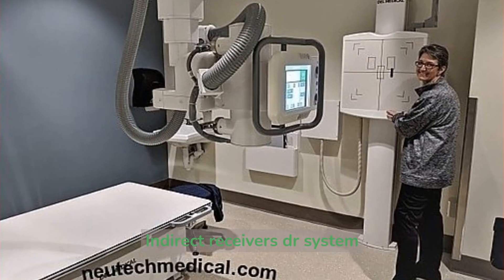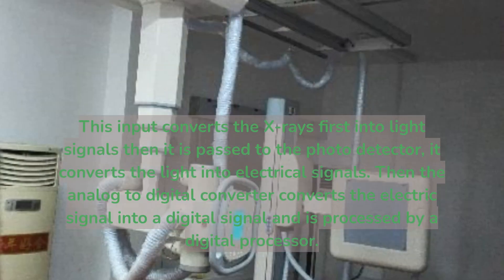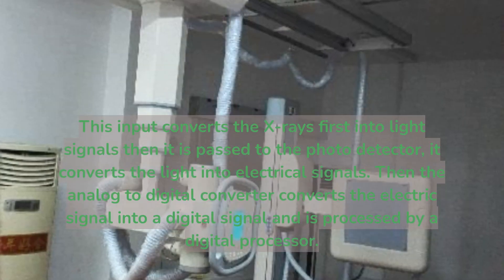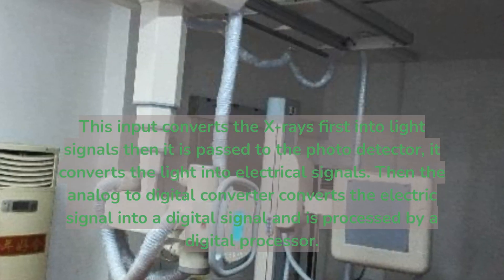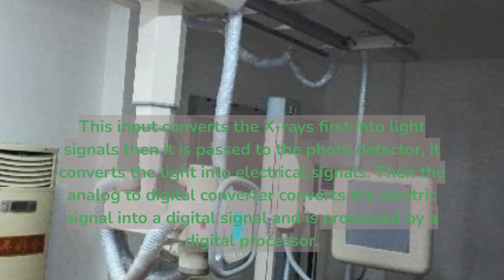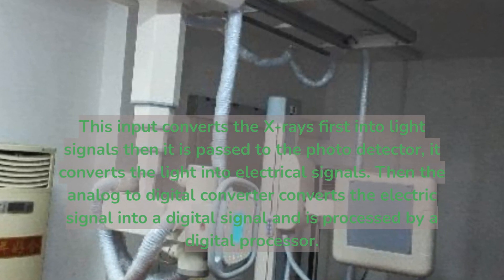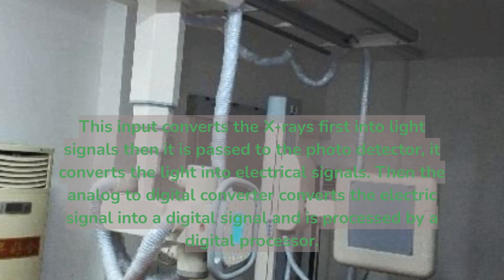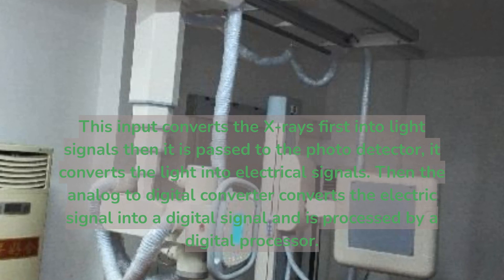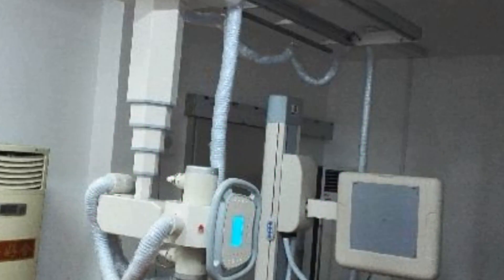Indirect receiver DR system: this converts the input x-rays first into light signals, then it is passed to the photodetector, which converts the light into electrical signals. Then the analog-to-digital converter converts the electrical signal into a digital signal, which is processed by a digital processor.